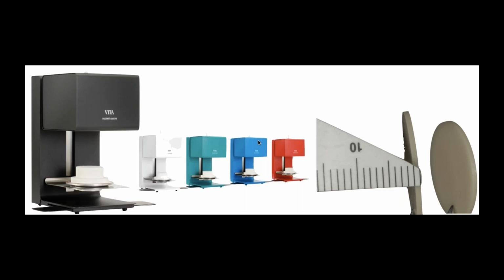And ceramic is like any other product. It's really about the maturation and how you understand how to fire that in the furnace and the time it takes to bring that up to temperature and get the most maturity out of the ceramic without over firing it and turning it into a glassy matrix. So managing those parameters and those temperatures are so critical for me.